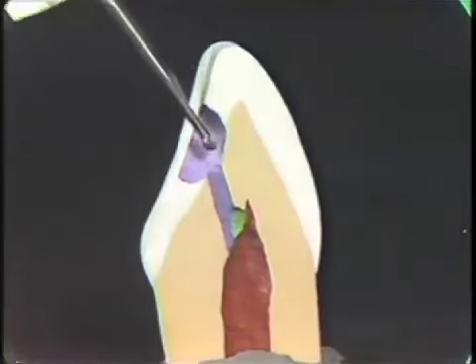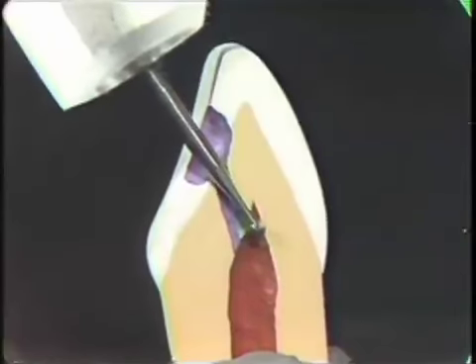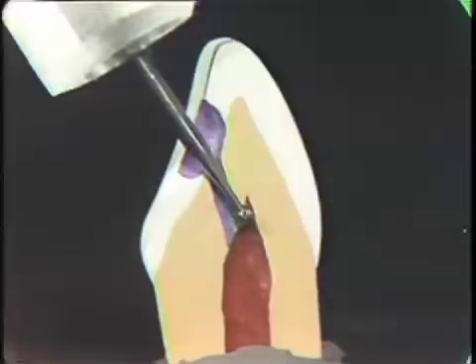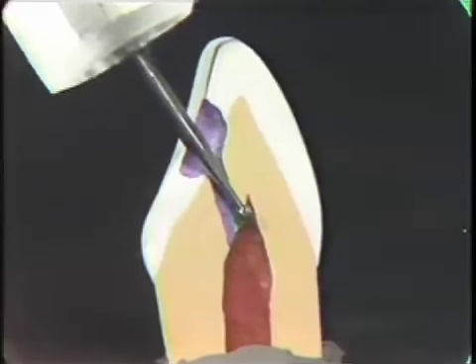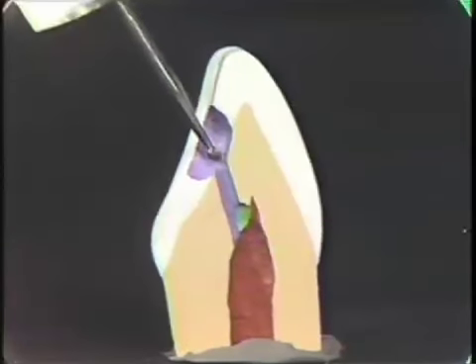Okay, returning the burr into the pulp chamber, feeling for the wall, keeping away from the wall, recognizing where the roof of the pulp chamber starts, you slowly remove the pulp chamber, working from the inside out.